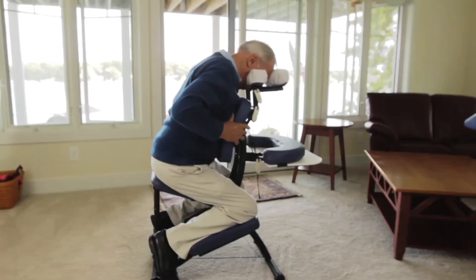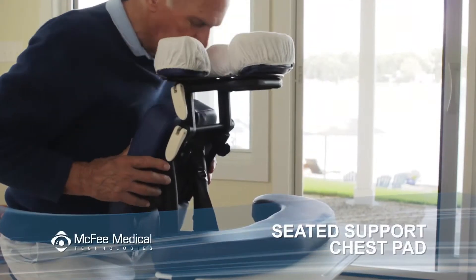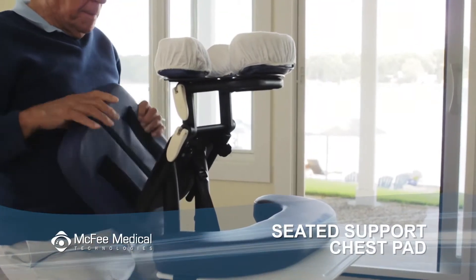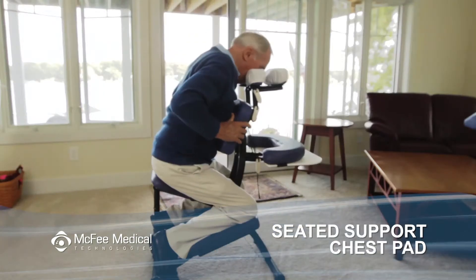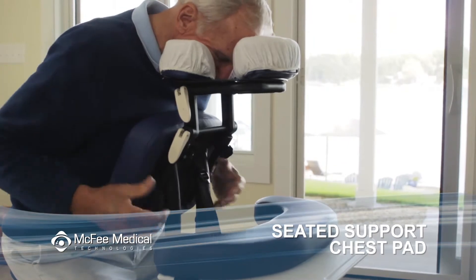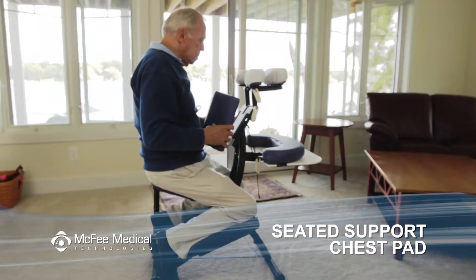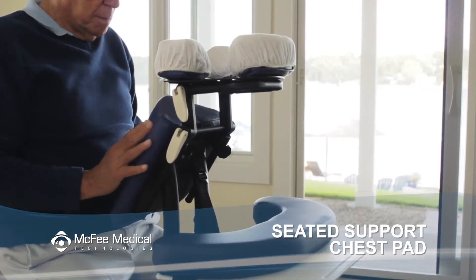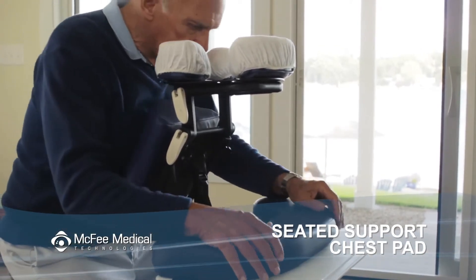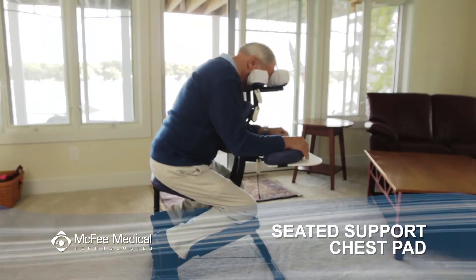The velcro attached chest pad can be adjusted to a higher or lower position on the chest plate. Some patients may find it more comfortable to turn the chest pad sideways. The triangular sternum pad can be turned either horizontally or vertically, and can be used for extra support and comfort for larger breasted or barrel chested patients.